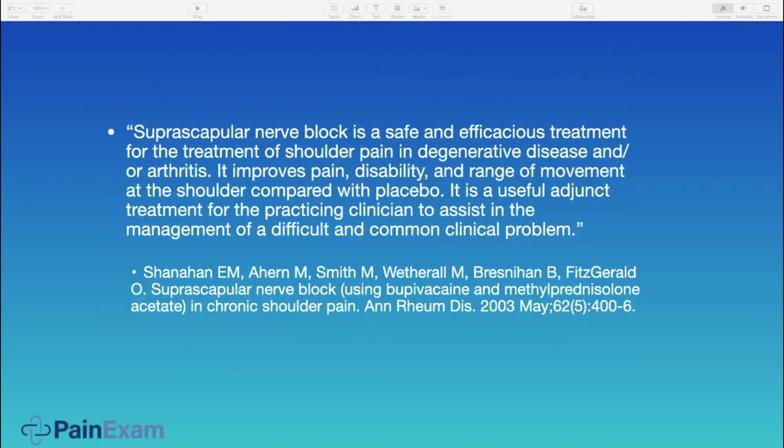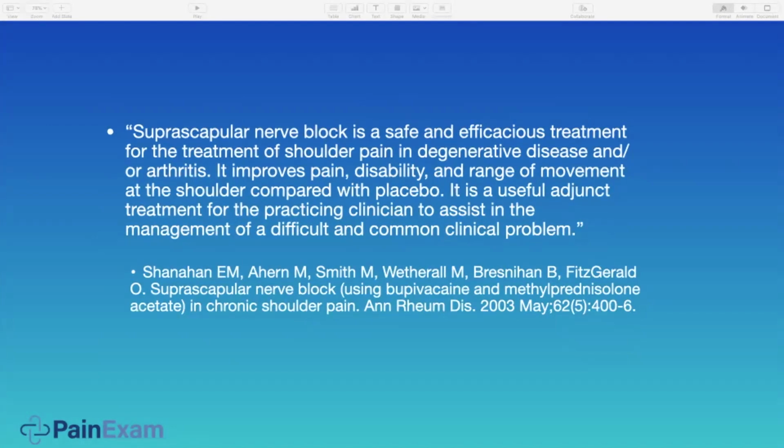For non-specific shoulder pain, rotator cuff tears, I think I've avoided rotator cuff surgeries for many of my patients with this nerve block. Or post-operative surgical pain. When the orthopedic sends the patient, they've already been through the subacromial shoulder injection, the glenohumeral shoulder injection. So there's really a lot that we can offer the patients that they were not yet offered.